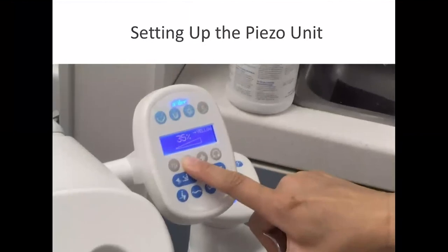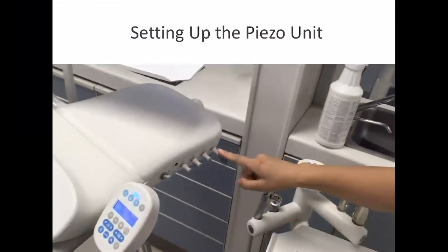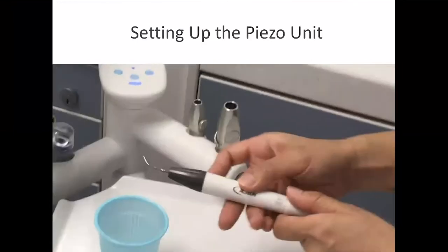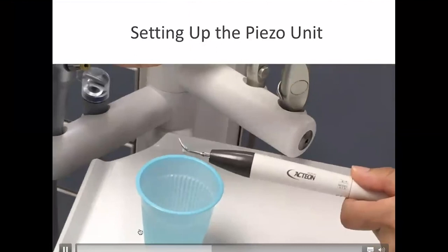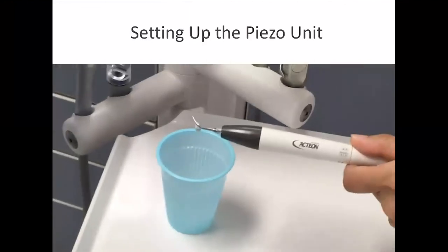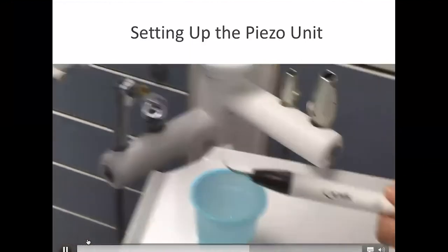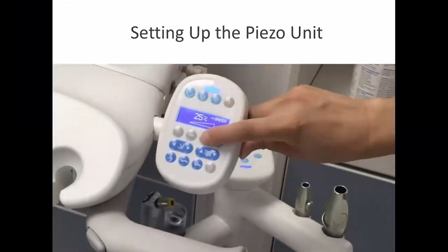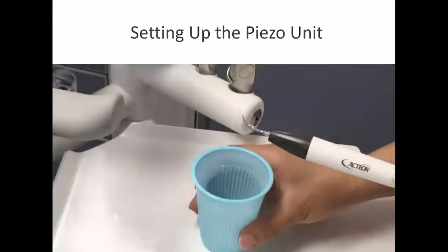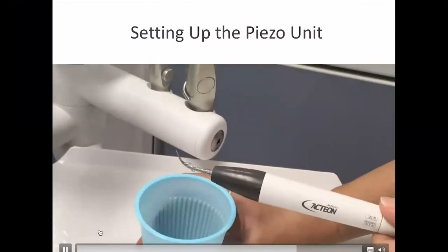Now, taking a look at the water adjustment: go to low power regardless of the color of the tip, then adjust the knob to achieve drop-by-drop flow at low power. Using a blue ring tip, now go to the power setting to achieve rapid drip flow.